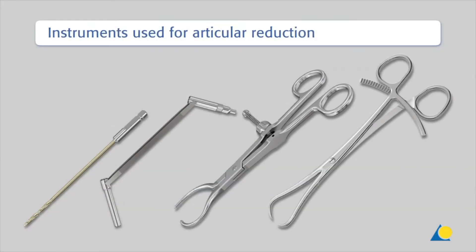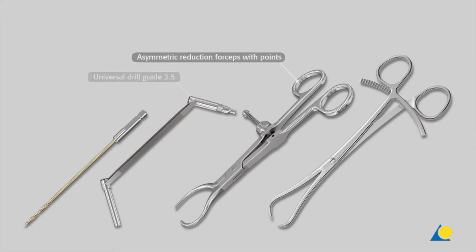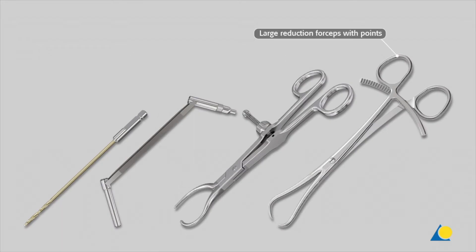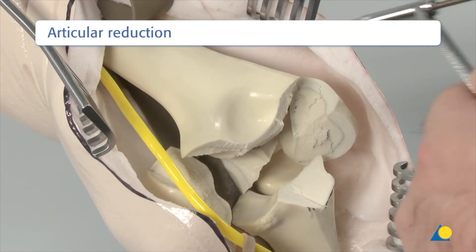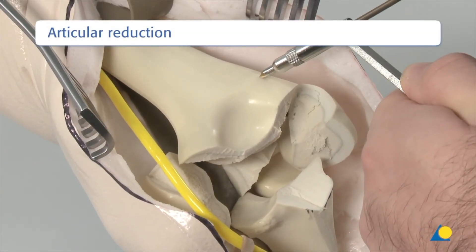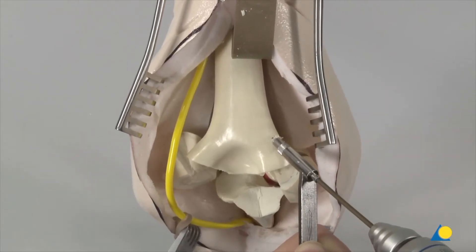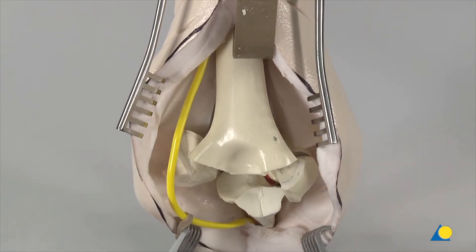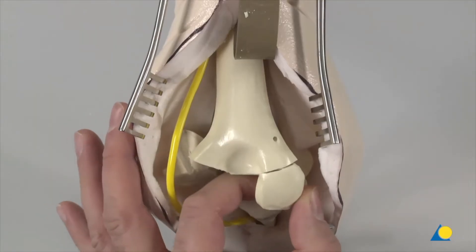The proximal ulna is reflected to give an excellent view of the fracture and the intermediate fragment. The next step is the articular reduction. To allow an easier application of the asymmetric reduction forceps, a 2.5 mm hole is made in the radial cortex. The radial column fragment is reduced and held temporarily with the reduction forceps.